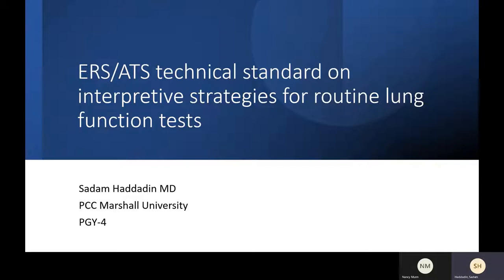A special consideration for the DLCO: it usually requires adjusting for the equipment dead space and the barometric pressure altitude when we do it. Any change in hemoglobin, carboxyhemoglobin, and the carbon monoxide back pressure can also affect the reading for the DLCO. This is especially important for people with close monitoring. Any medication can affect the DLCO, especially chemotherapy, so you have to be worried about the hemoglobin and the carboxyhemoglobin.